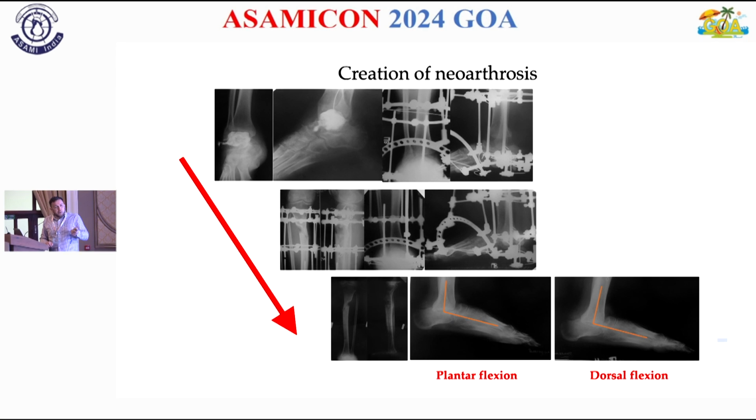And important here is that we don't try to make arthrodesis between the tibial bone and the calcaneum bone. We are trying to save a free space, something around 10 millimeters, for creation of fibrous tissues. Because we have a safe function, you can see plantar flexion and dorsal flexion, not bad, I think, especially in a case where there was a previous infection process.